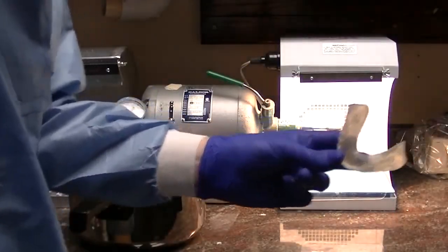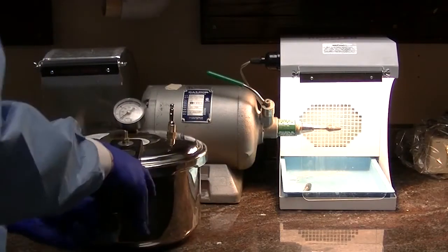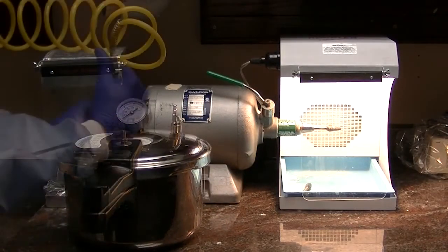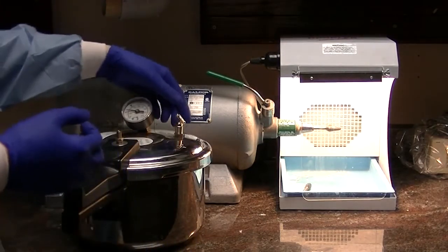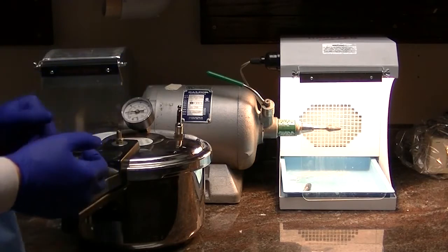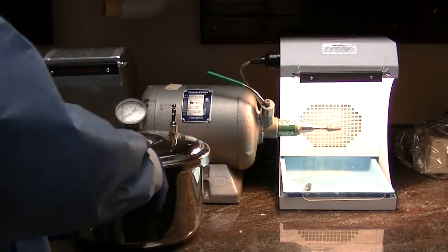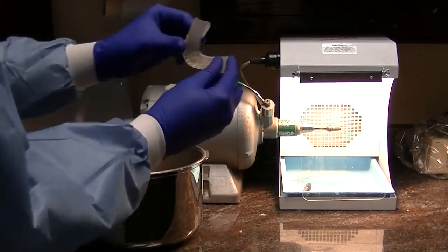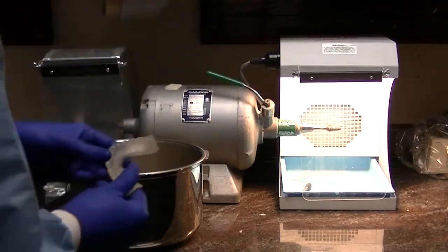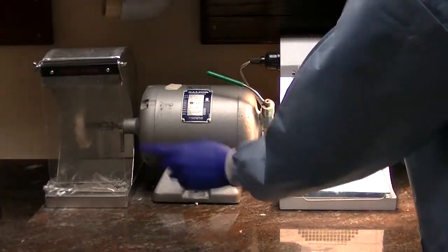And back into the pressure pot. At the completion of 15 minutes, we're going to go ahead and release the air valve, and open the top lid to verify that that resin has been successfully added. Then we're going to finish up some of our polishing using my lathe burr and my rag wheel.